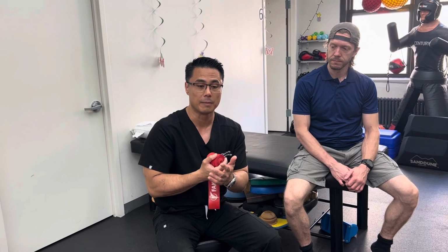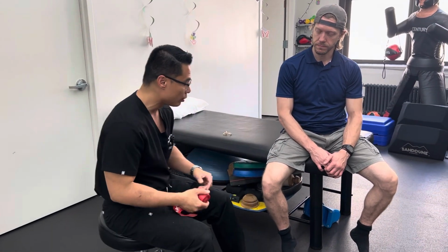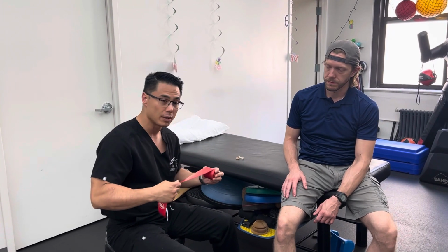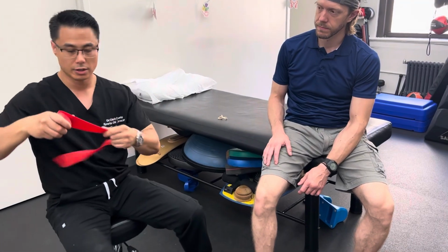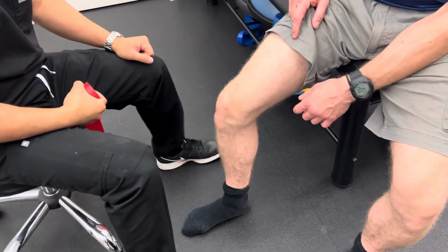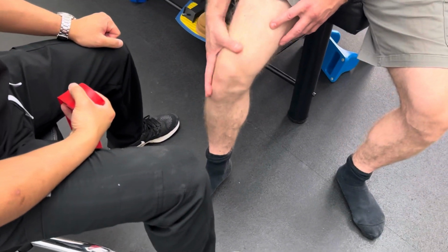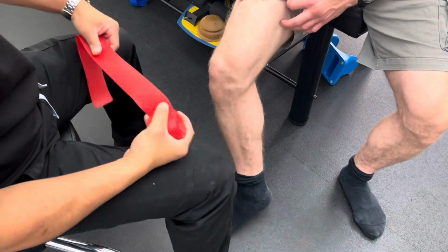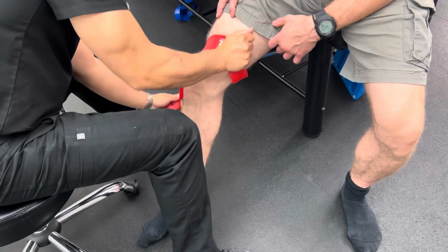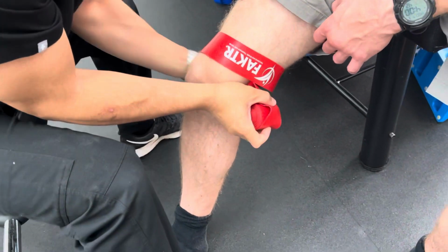of myofascial restriction involved. So take, for example, Coach Dillon here, who has a chronic issue with his knee. Now we're going to start wrapping with the FAKTR floss. Where's the issue? Or is it just in general? I would say it's around this area, and then in the back. So a lot of times I may target it going through here. For example, I'm going to go right at this area, wrap it around, and make sure it's tight.